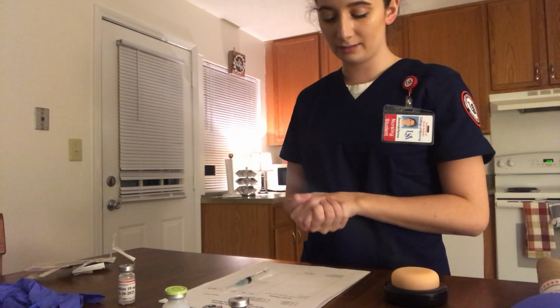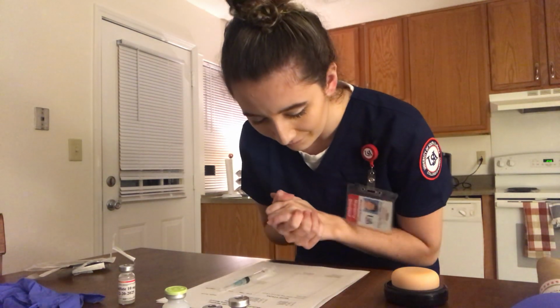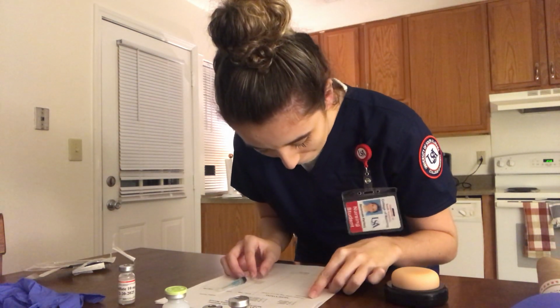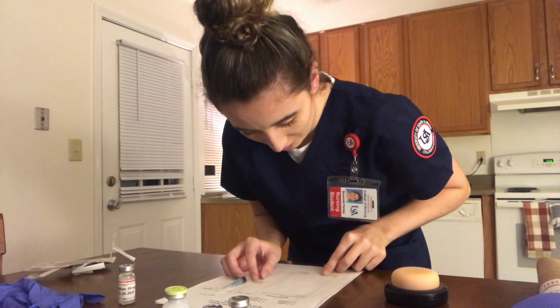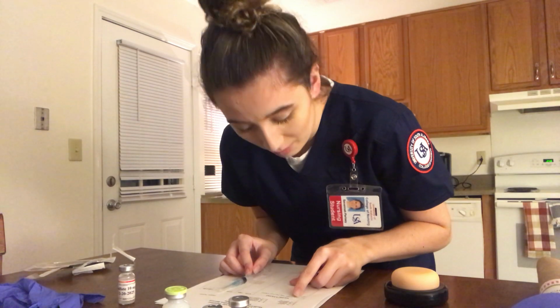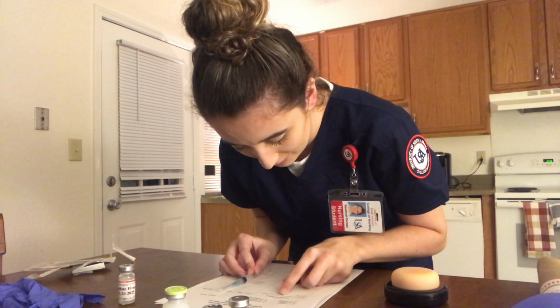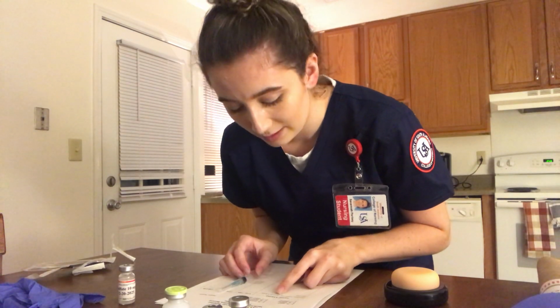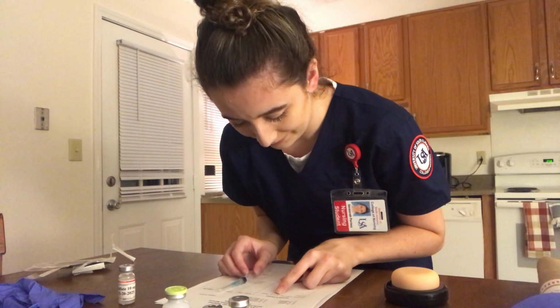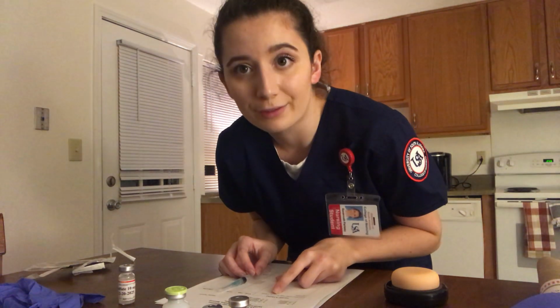I would then verify the 5 rights again. My patient's name is Jaguar Jones. I am giving him morphine sulfate, 5 milligrams, 1/2 milliliter. The route is IM, and the time is every 4 hours.